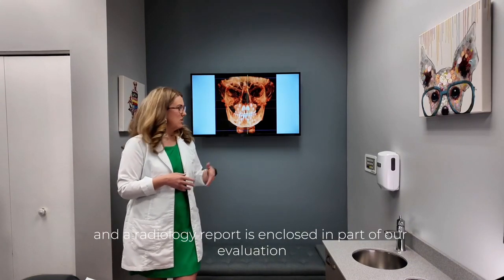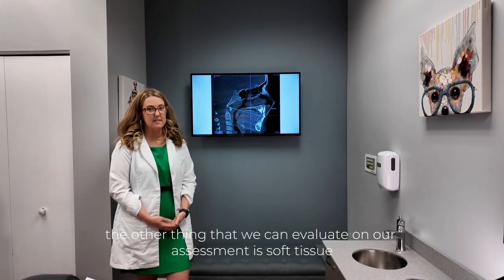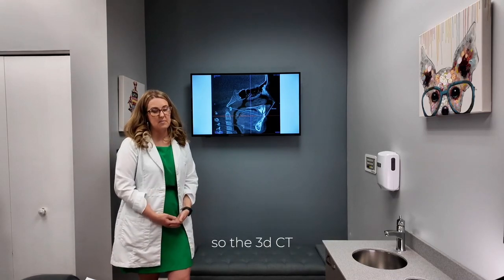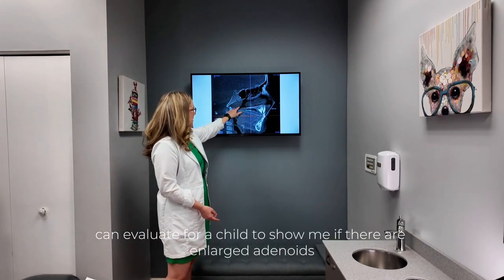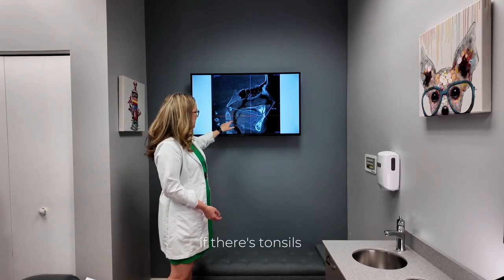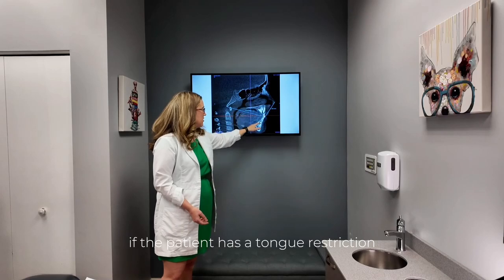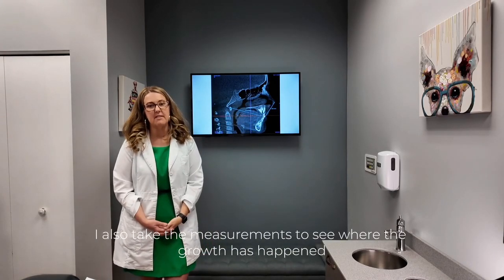The other thing that we can evaluate on our assessment is soft tissue. So the 3D CBCT can evaluate for a child to show me if there are enlarged adenoids, if there are tonsils that are enlarged as well, if the patient has a tongue restriction. I also take the measurements to see where the growth has happened.